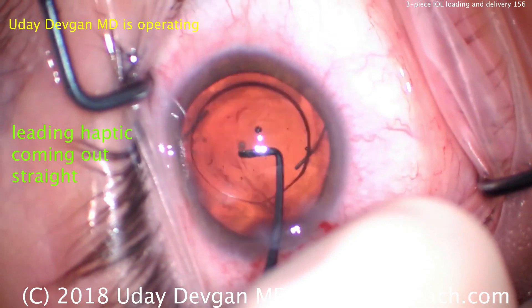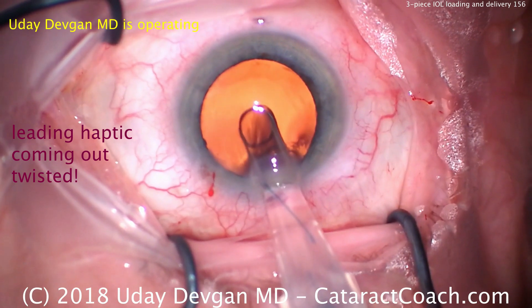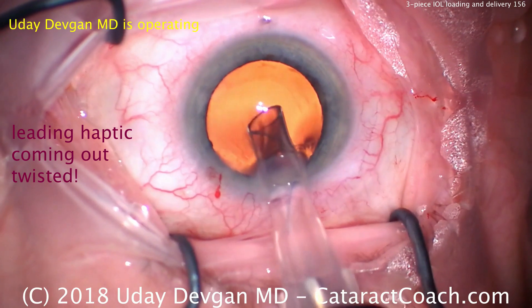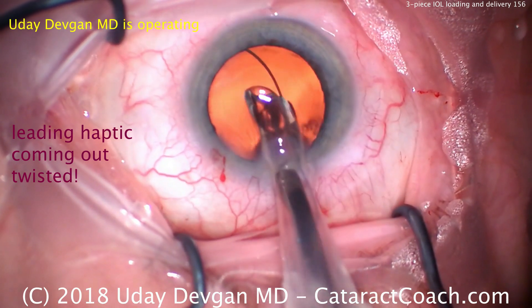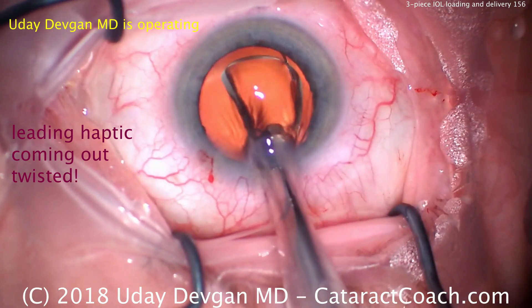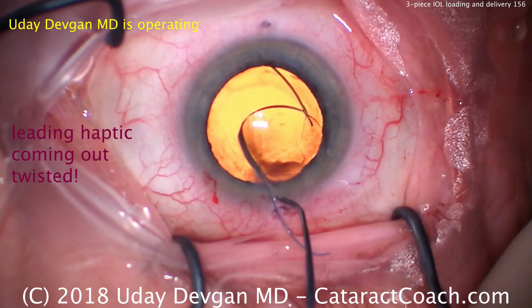This ultramyopic patient looks great. But what if the haptic comes out the other way? Here's a lens being injected in the eye — look at the haptic orientations; it's twisted in the injector. As we start to deliver it, we notice the haptic is not in the correct orientation. So we'll flip it around — it has to come out like a number seven. There it is. Now turn the injector tip to make sure the optic comes out correctly — the injector tip turns over, and the optic comes out in the normal orientation.